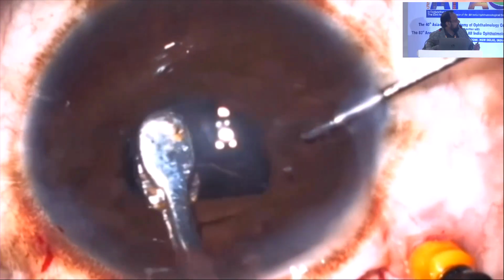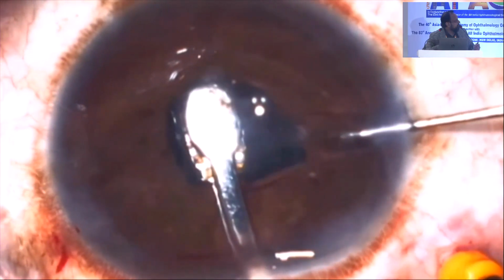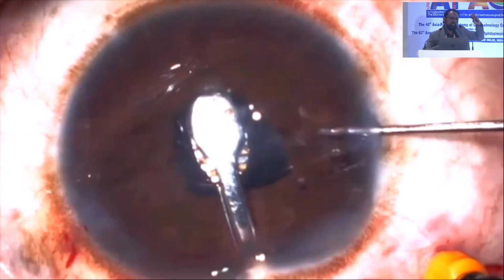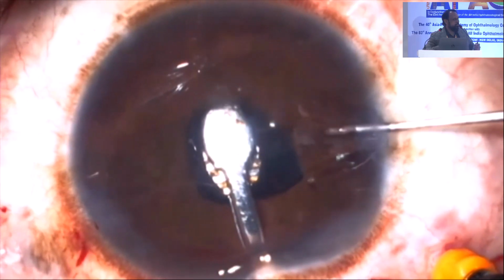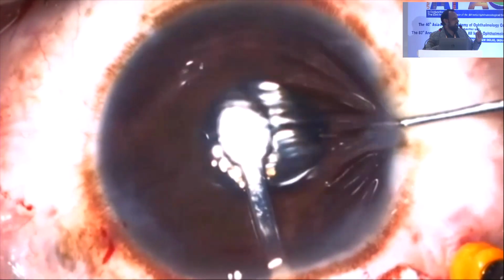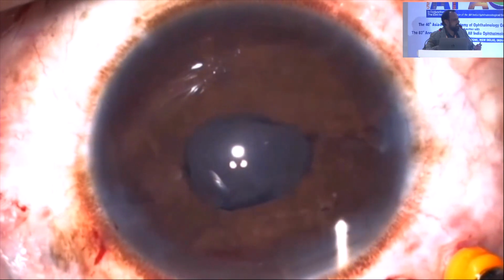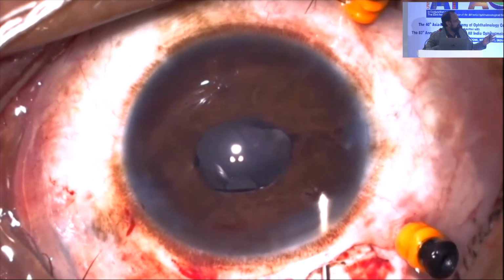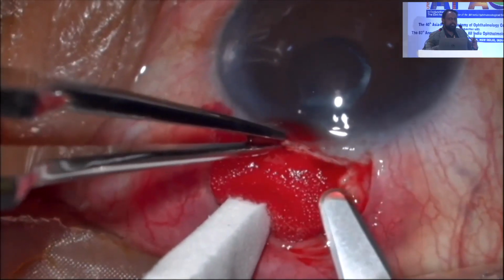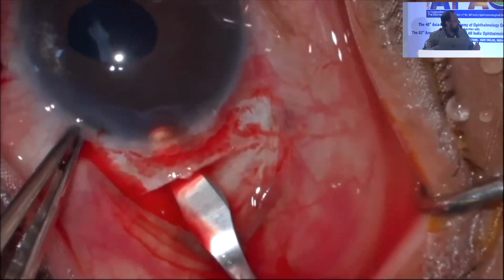So there, just going inside, making sure you know where you're going to clip, because when you push your lens, you can actually see the iris lifting up. That makes it easier, and you don't have to give too much force. It is just some amount of partial tissue that gets enclaved here, and you don't have to have the entire iris tissue going inside. You do get nice round pupils and a moderate amount of dilatation to see the post-op fundus, because there was a lot of debate compared to the other lenses.